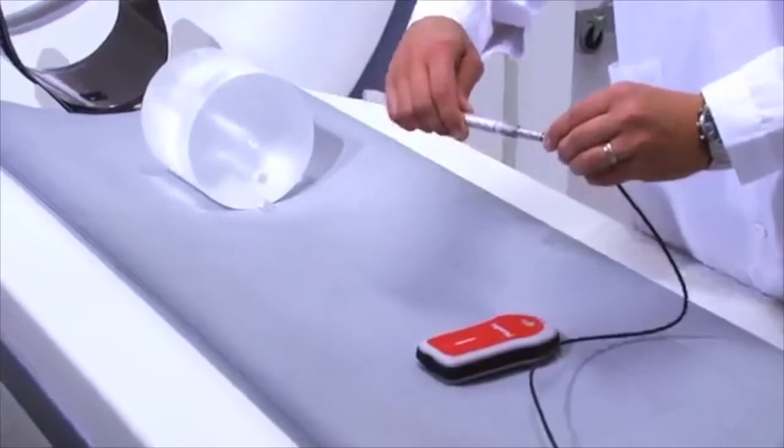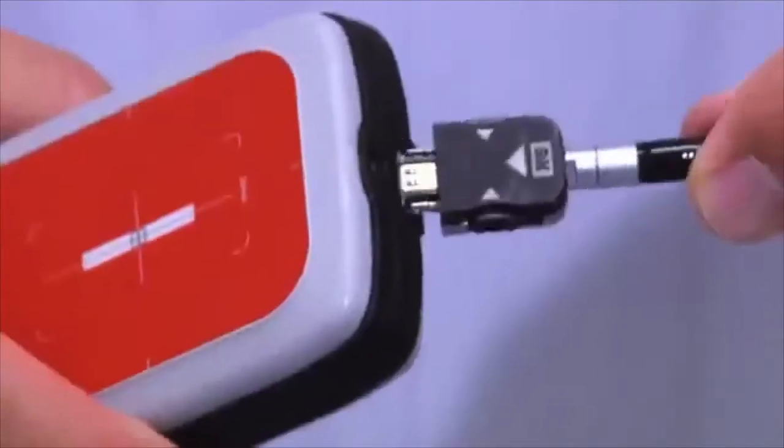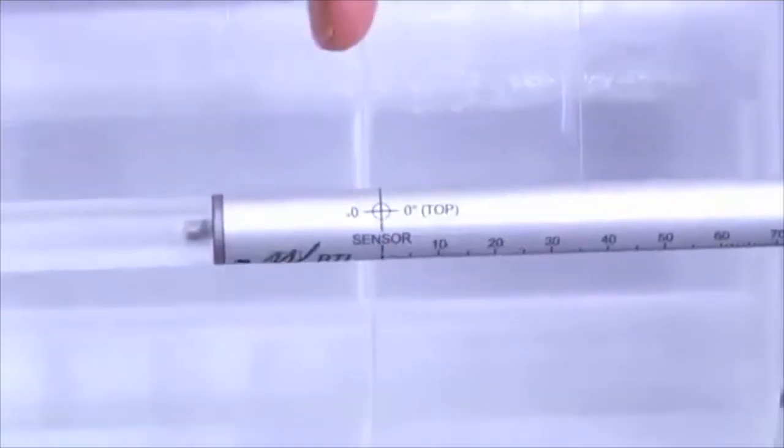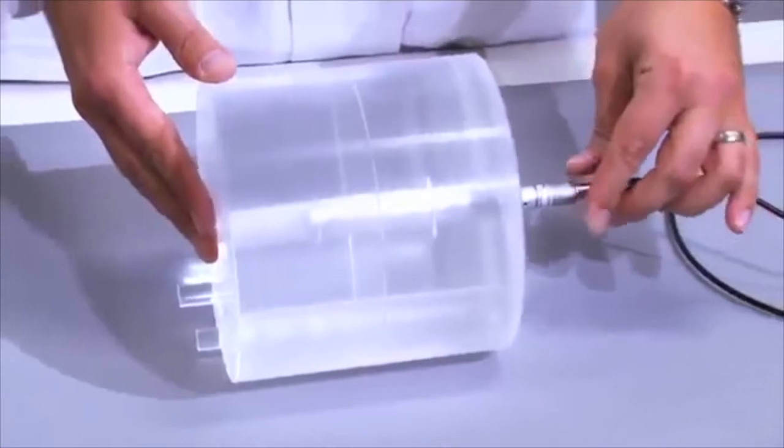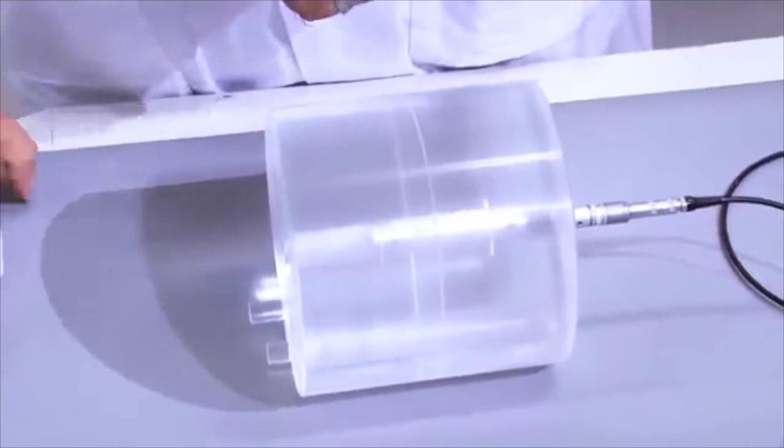First, we have to set up the phantom and insert the detector. The detector should be placed in the central hole and the detector sensor should be centered. Make sure that the detector doesn't move during the exposure. This can be done by fixing it with some tape, for example.